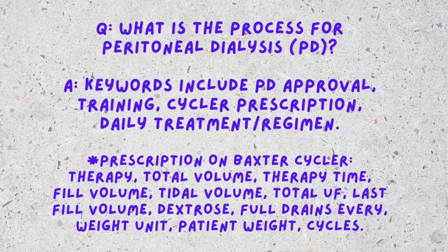There is also the manual peritoneal dialysis, like a backup in case you need extra cycles of the treatment during the day, or if you have a power outage and you're not able to use the machine, you also have the manual option. So the nurse is also going to teach you how to carry out the manual option if the machine is out of commission or there's no power in your area.